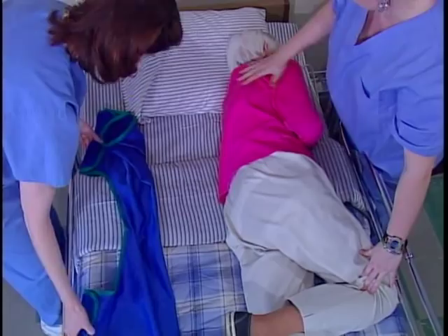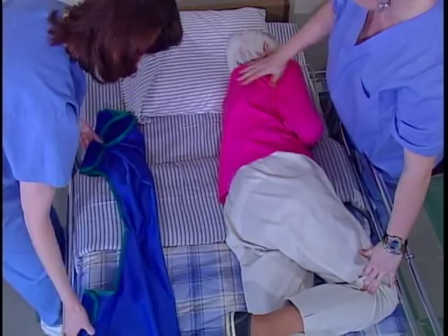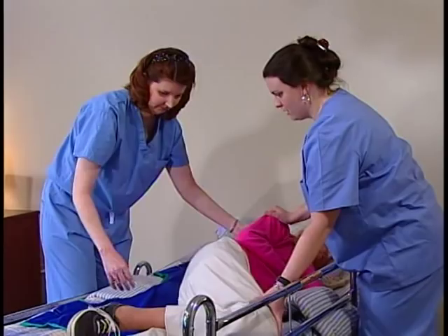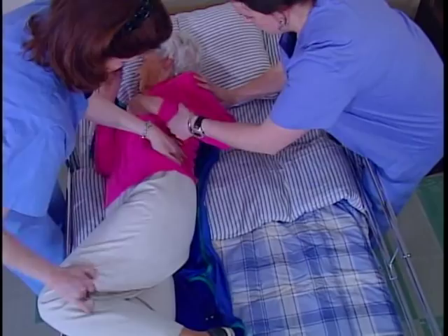As the other caregiver holds the resident, push the sling underneath them. Roll the resident again onto their back, then roll them over on their other side using the same technique. Smooth the sling out on the bed, then roll the resident again onto their back.